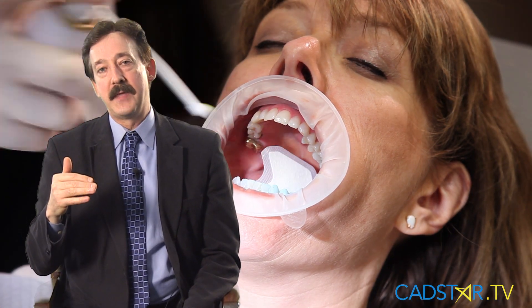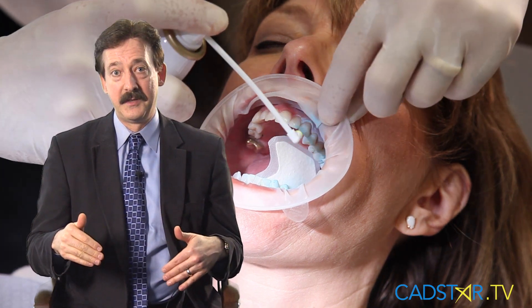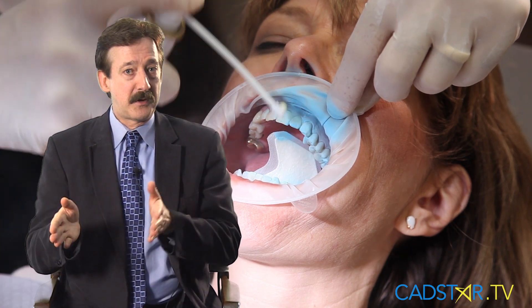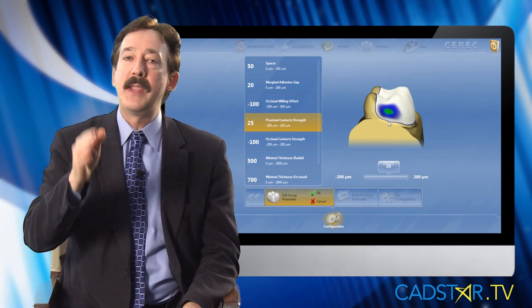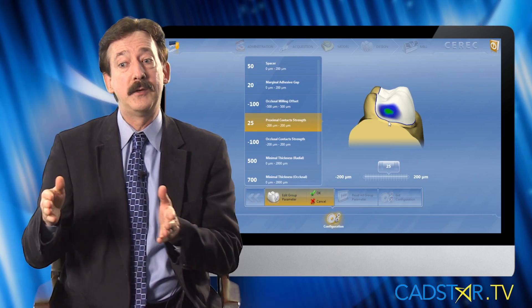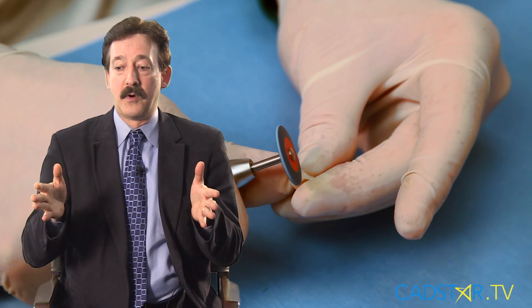Green slightly speckled with light blue drops in on all five of my MCXLs coming from ten different computer systems. Another factor that can impact proximal contact strength is how you place your reflective medium — that's pretty customized. So a proximal contact strength recommendation is a place to start, and it may vary for you depending on how you like to finish your proximal contacts.